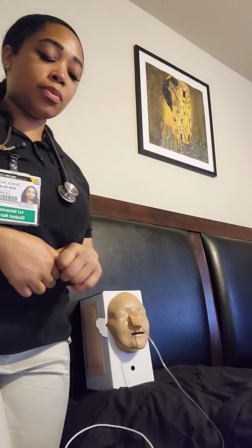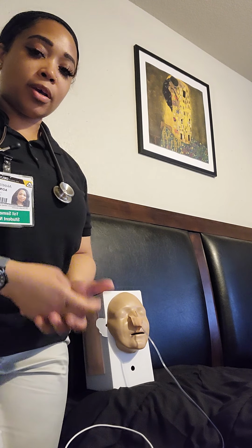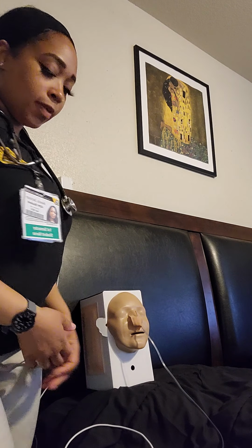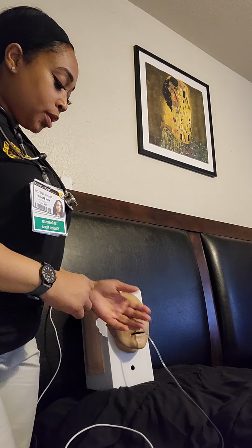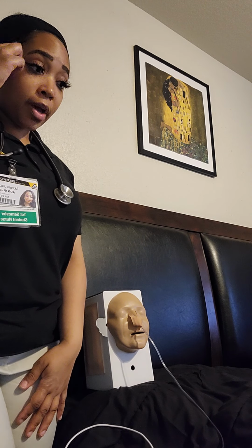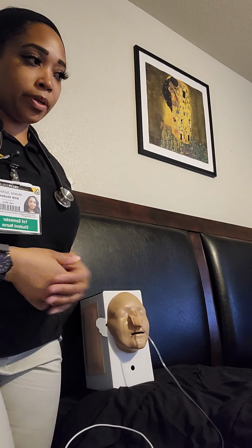So the first thing I will do, of course, is check my patient's chart, look for any orders, perform hand hygiene, enter their room, provide privacy and adequate lighting, introduce myself, and verify who my patient is, prepared with their ID, and explain to the patient I will be doing a tube feeding for them. I would have to check the residual first to make sure that tube feeding is appropriate.